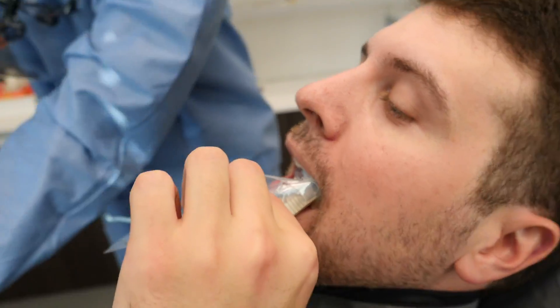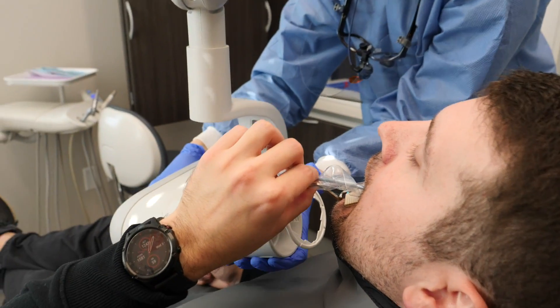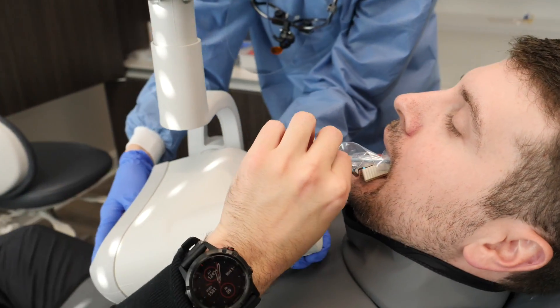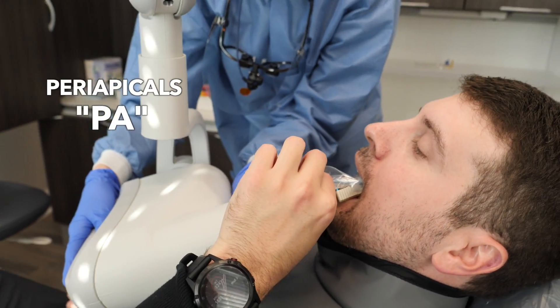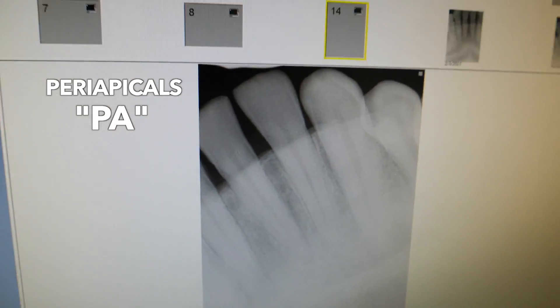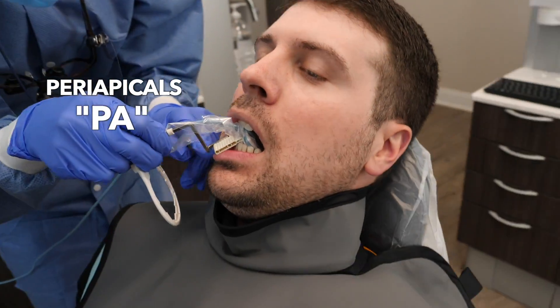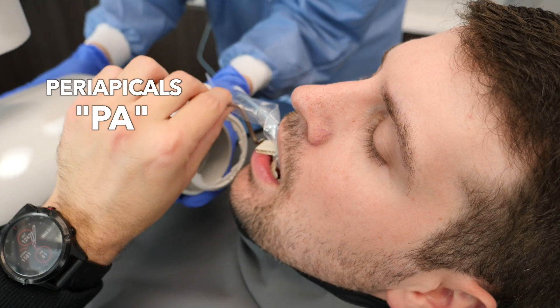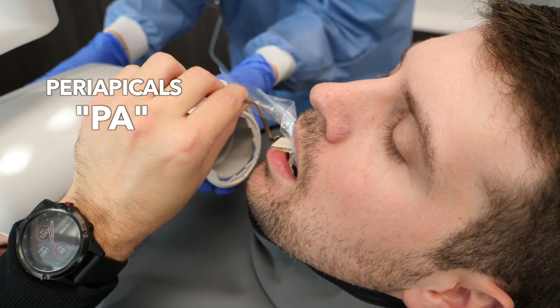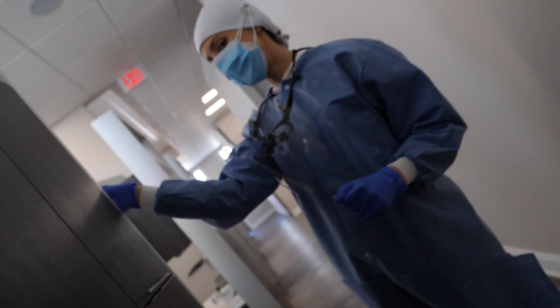Now, back to the x-ray terminology I was using at the beginning. Right now we are taking PAs, which are also known as periapicals. These allow us to see the entire root and the area all around it — for example, to check for an abscess and assess the general health of the tooth.